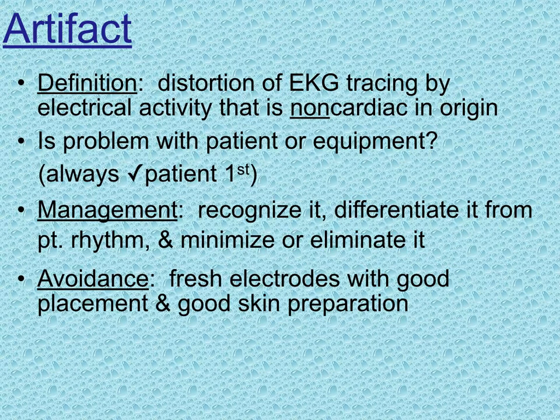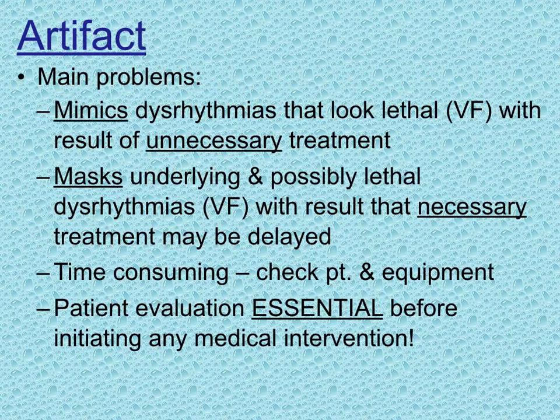These electrodes do dry out, so when you're in the hospital setting, if you have a patient on continuous cardiac monitoring, you may need to change those every day to be sure that you keep good contact so you have a good tracing. So why are these considered problems?